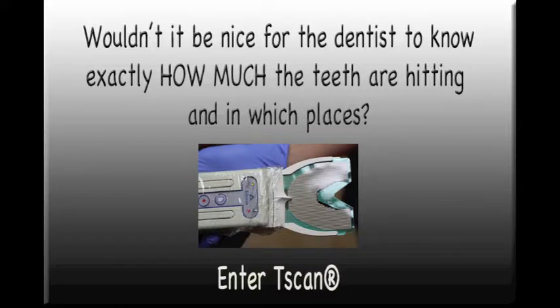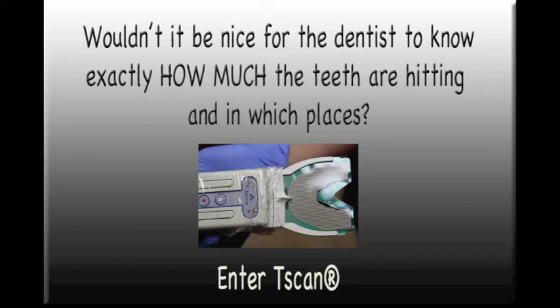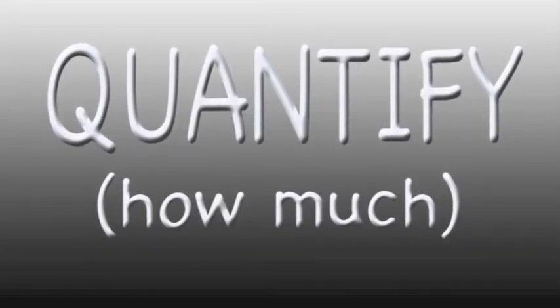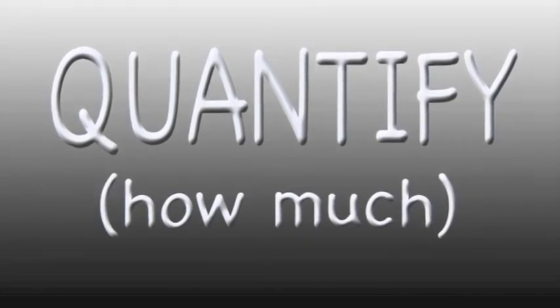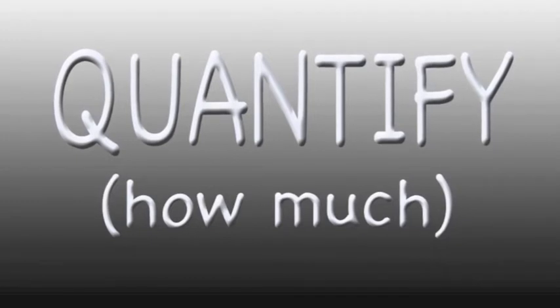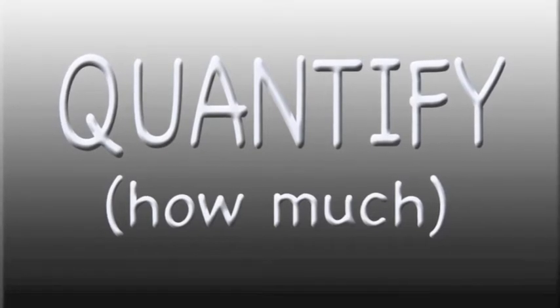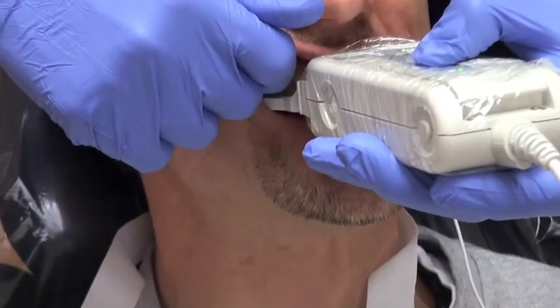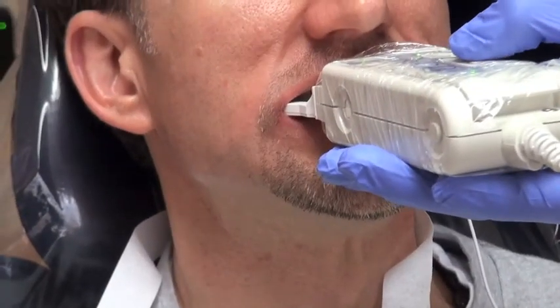Think about it. As this fluid and dynamic system moves, ebbs and flows, the teeth rub this way, then that way, but not exactly the same way again over time. What if within this movement there lies an interference or speed bump between a top tooth and a bottom tooth that does not belong there? Trouble. Research has proven that the ink ribbon does nothing to quantify or show how hard or how much the teeth are hitting one another, neither when simply biting together nor once dynamically moving in the elaborate patterns that we all engage in thousands of times a day.